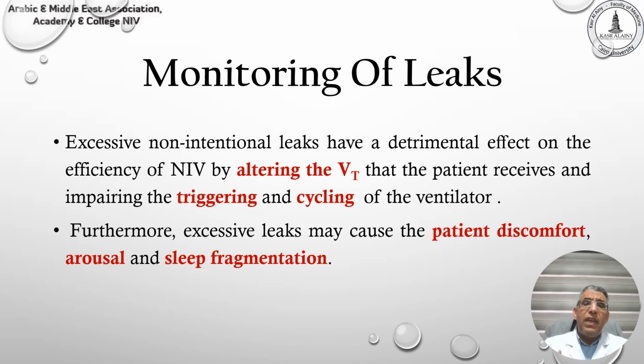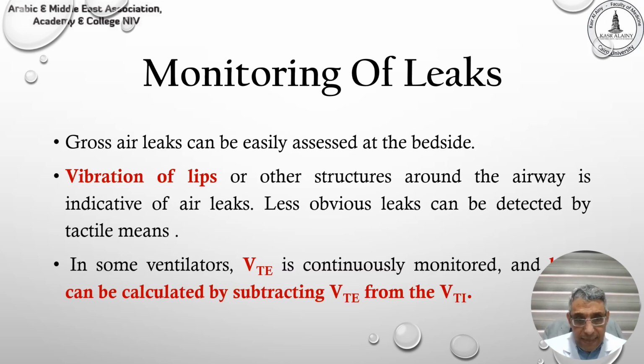What is the problem with the leak? The leak will lead to decreased tidal volume, impaired triggering, impaired cycling, patient discomfort, arousal from sleep, sleep fragmentation, and asynchrony. So how do we manage it? At first, diagnose that the patient is leaking.